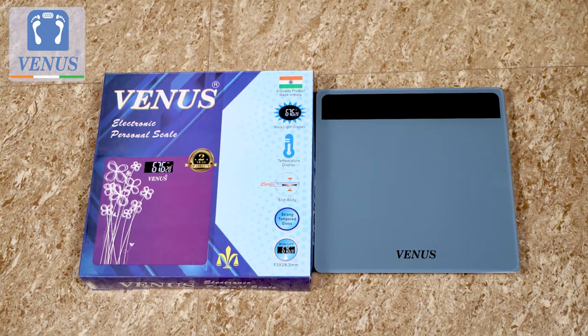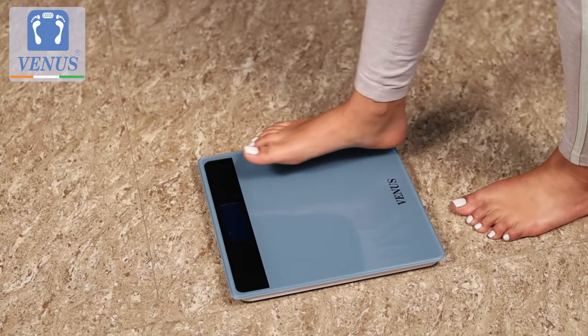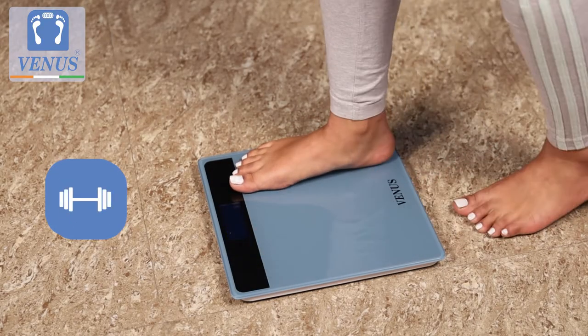Introducing the Made in India Venus Body Weighing Machine — the simple, easy and reliable way to monitor your weight at home, office, gym or a clinic.